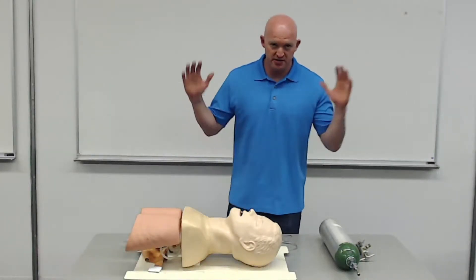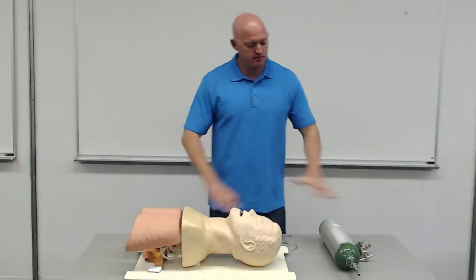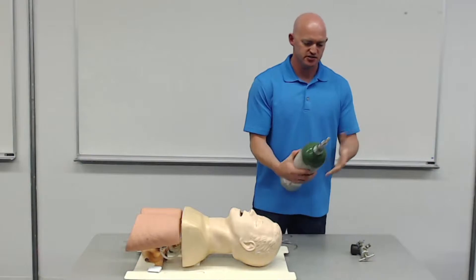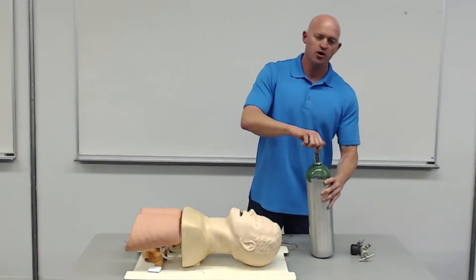This is oxygen administration. BSI, scene safety. I'm going to assemble all of my equipment. I'm going to grab my bottle and look for any obvious damage or problems with the tank. I'm going to crack it open just to get rid of any debris that might be in the stem.